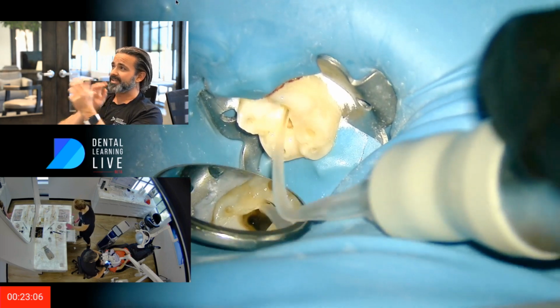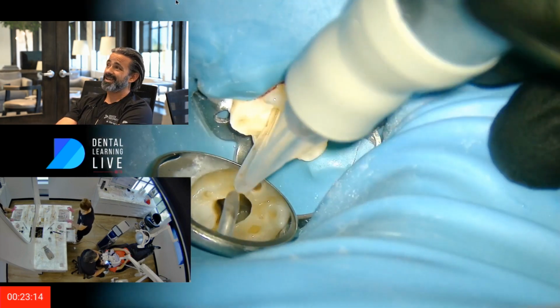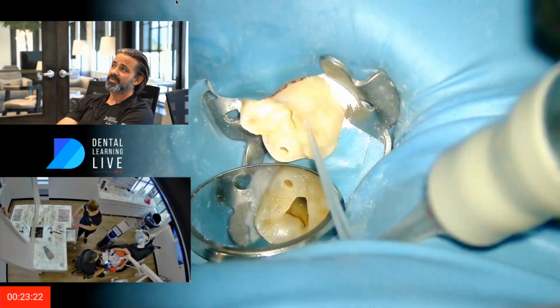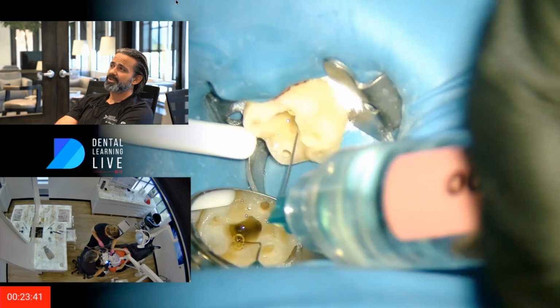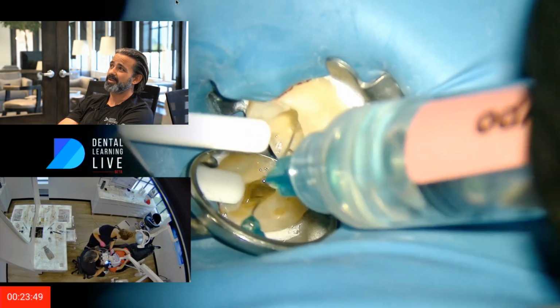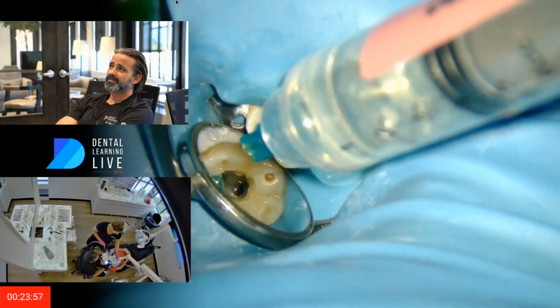So I'm going to suction out with a little micro suction just to look down these canals once the bleeding stops. And you know what? The time it takes to take an Xray is usually the time it takes to get the bleeding to stop. I take that Xray with those cones. See, there it is right there. Those cones are in saline when I took that Xray. So I'm still flushing it out, but really look at that mesial wall and you'll see that little troughing that I'm trying to explain. It is a lot easier when you're behind the microscope to pick up on these little details than it is through a video, but trust me, it's there.